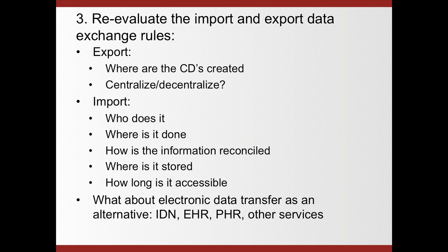Now let's start with the export. So first of all, where do we create CDs? There are opportunities to centralize that. For example, you might say all the CDs are created in a file room, and some PACS systems actually allow physicians, technologists, and whoever is authorized to create another copy. Some PACS systems allow that to be done remotely, so you can just say, I want a CD to be generated for this patient, this exam.